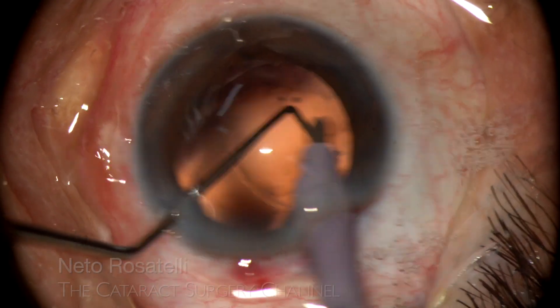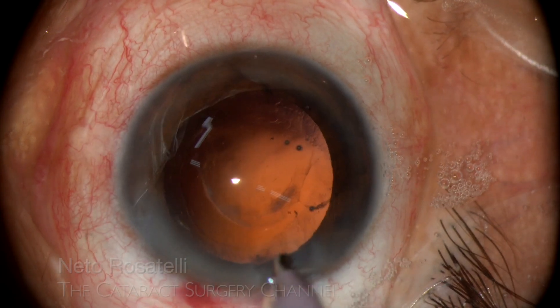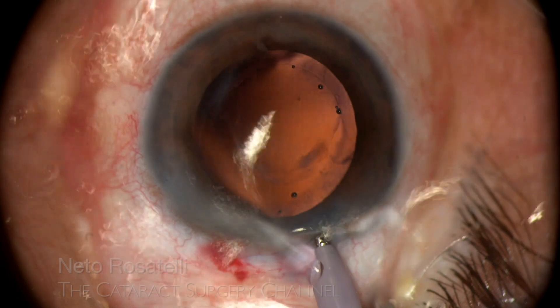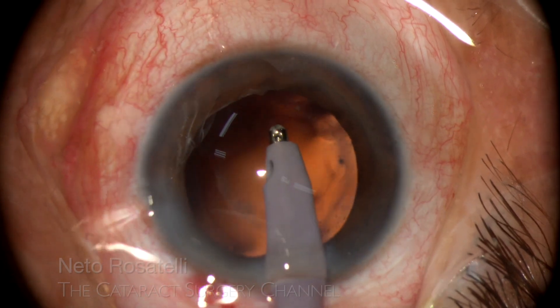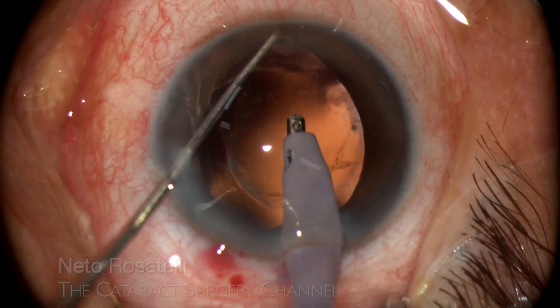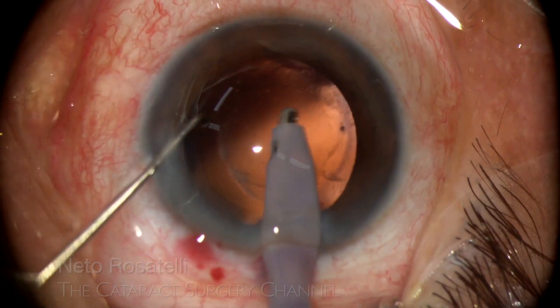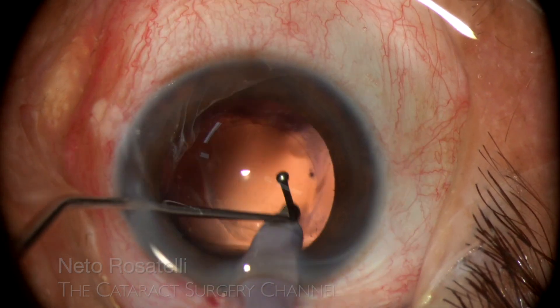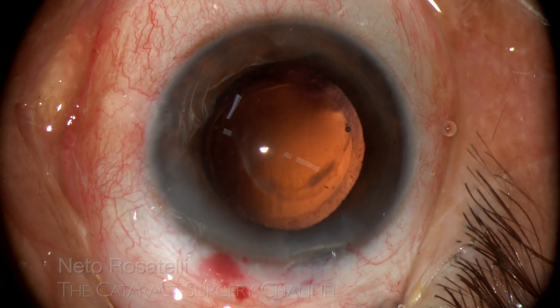There is some central fibrosis that will not come out by polishing. Some stringed cortex remains and I go for the IA probe. I finish cortex cleanup and there was not much of it, mostly because of the nucleus spin done previously. I am not satisfied with this fibrotic posterior capsule — it is a ring in the middle periphery, the central part being relatively spared.